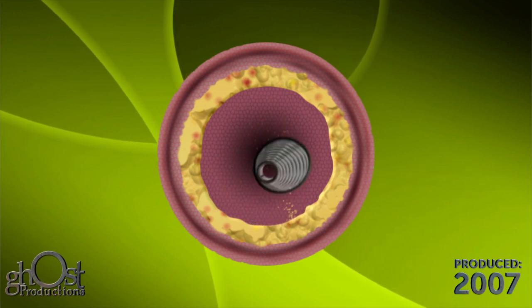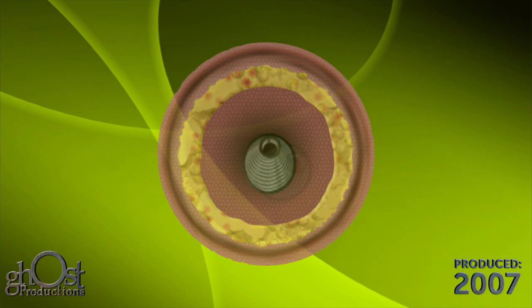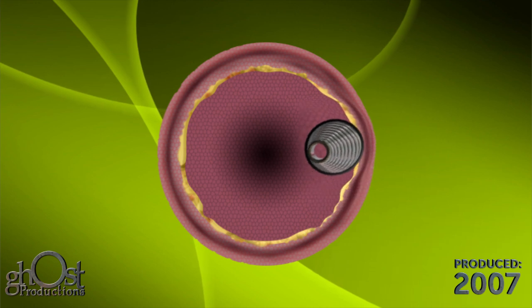The device is designed to deflect from compliant tissues. Multiple animal and human cadaver histological studies have shown the design of the crown sands away the plaque without harming the native artery.